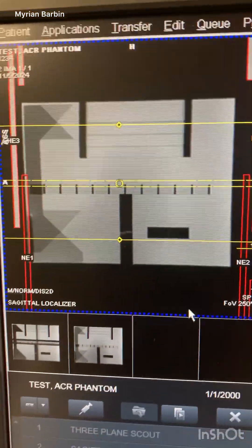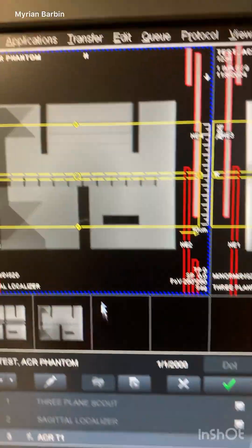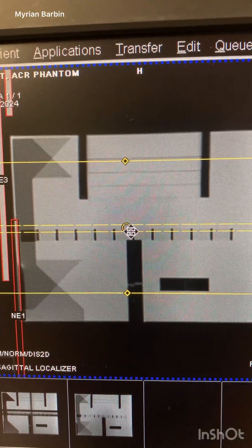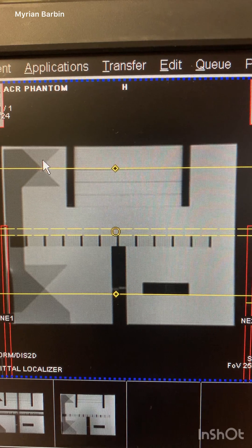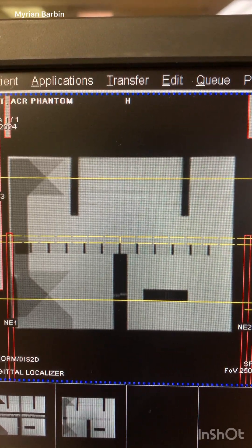Everything is done now. We're setting up the ACR phantom sequence — I want the yellow solid line centered where that triangle is meeting. I'm trying to get it in the center where the triangle meets, and then just centering it.